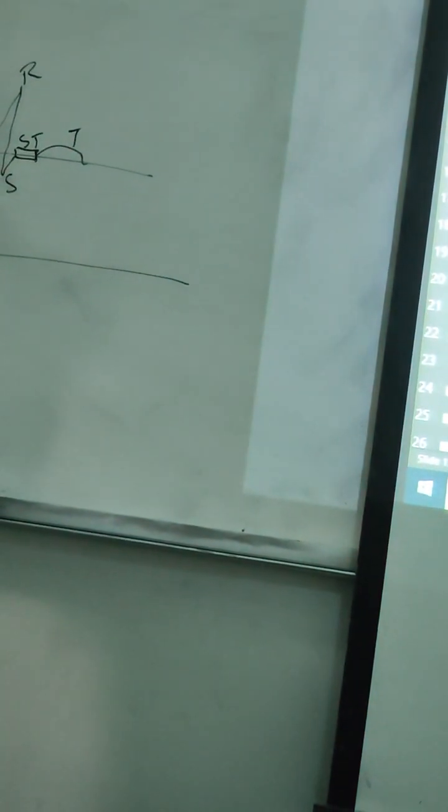Sometimes I don't even mark it, I leave just the graphic. Why? Because I know which one it is. Oh, what is the PR segment? Oh, it's from here to here. Oh, the end of the P, the beginning of the QRS. Ooh, I know it. I don't see the answer, no problem. The end of the atrial depolarization or contraction to the beginning of the ventricle contraction or depolarization. Ah, I got it. Yes, it is written there.